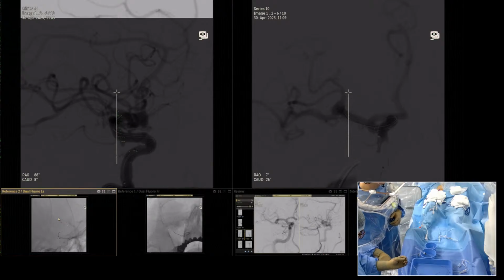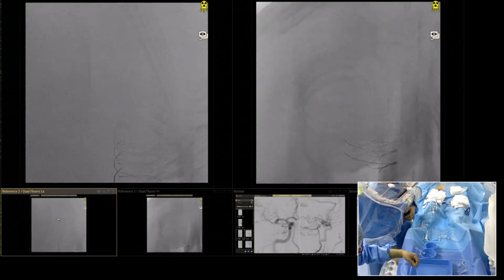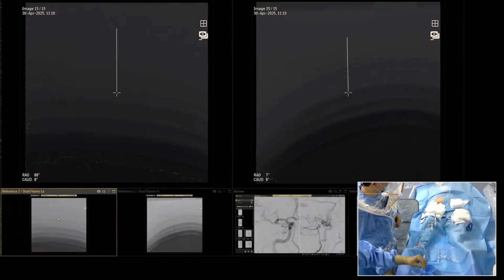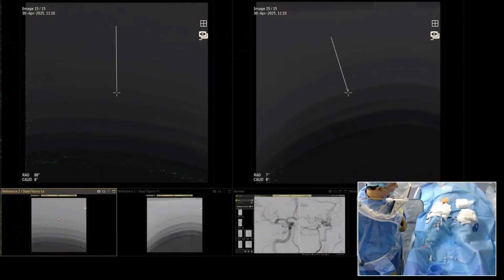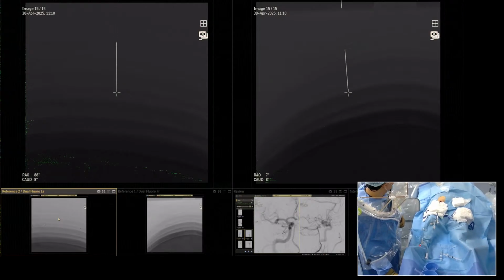Just a second, there is a ritual from Abzal. We need to put the table maximum. And then we need to go up.